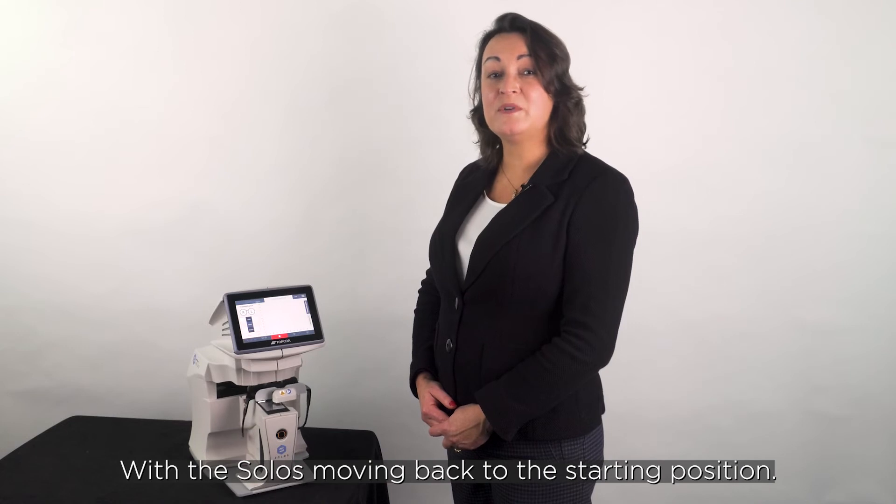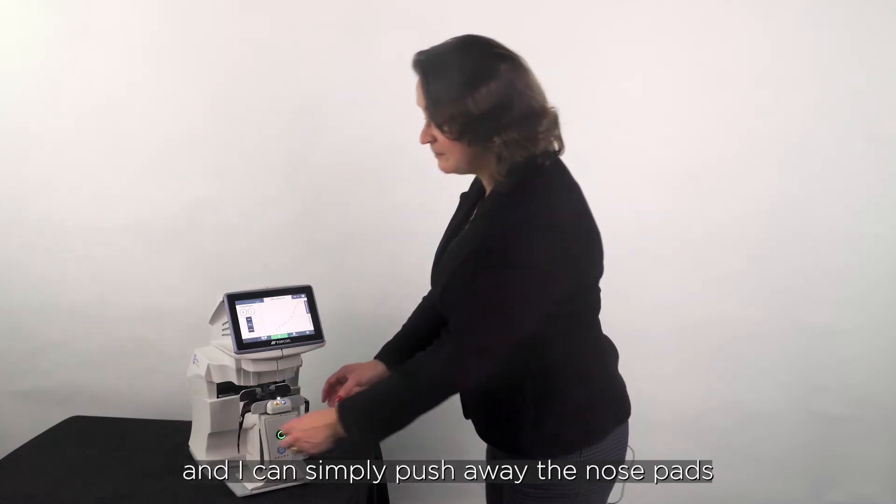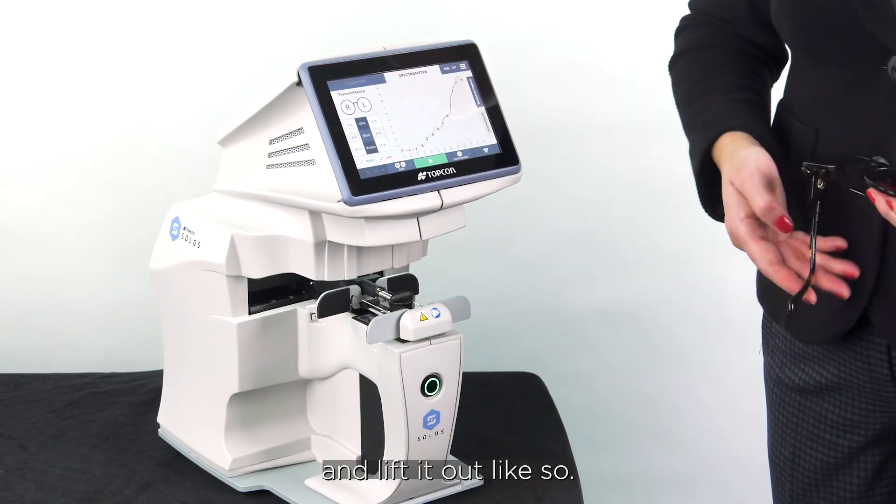With the Solos moving back to the starting position, the frame supports are released and I can simply push away the nose pads and lift it out like so.